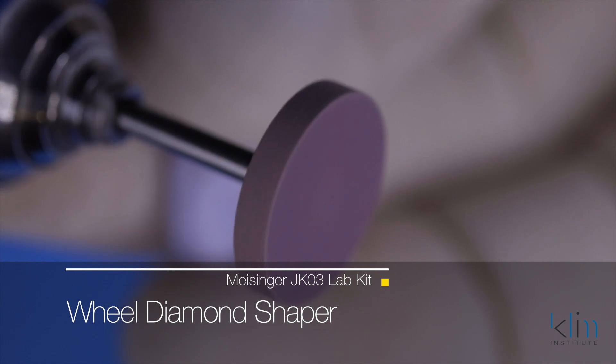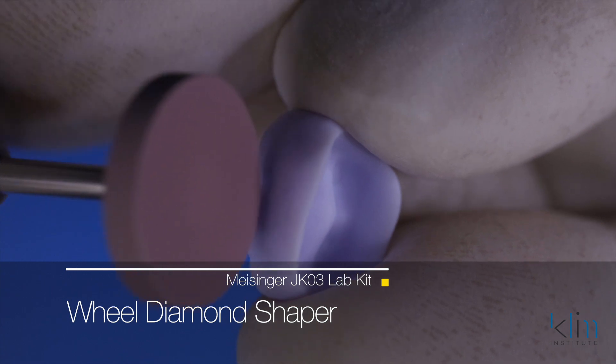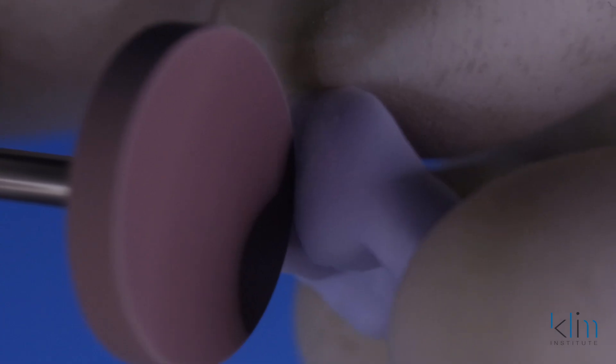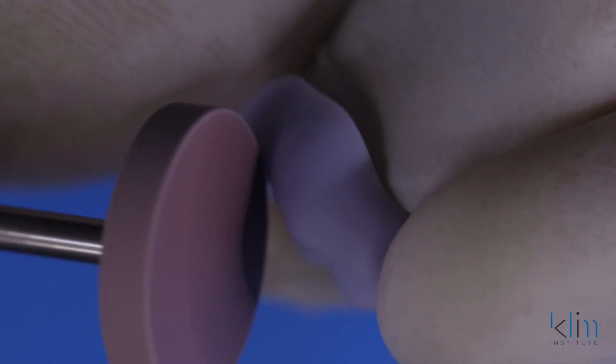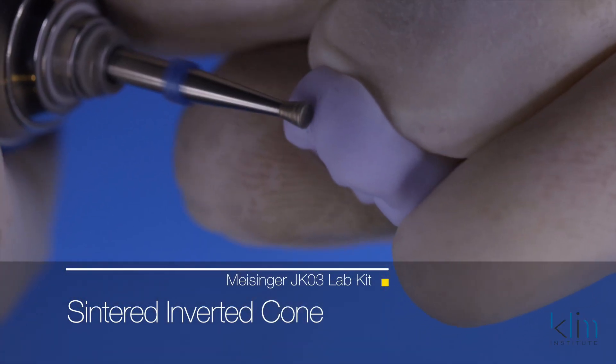I love this diamond wheel shaper. It's designed to rapidly remove ceramic and it's ideal for sprue removal and smoothing. A light touch with an RPM around 10 to 15K works effectively. Turn that wheel on edge — it's a nice carver to refine the external primary grooves. With a really light touch it works effectively and will not damage the ceramic or overheat it. Once we have the external grooves refined, our goal is to use a shaping instrument to completion. The next shaping instrument — one of my favorites — is the sintered inverted cone on the JK03 lab kit.